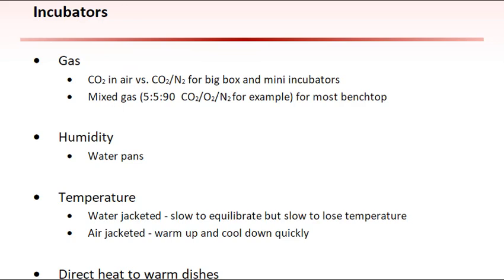Most incubator manufacturers produce incubators that can mix CO2 with room air at a designated concentration of CO2, or incubators that can mix CO2 and nitrogen, often captured from large liquid nitrogen tanks or a nitrogen generator, to create an internal environment acceptable for embryo culture. The purpose of pumping nitrogen into the incubator from an external source is to displace the oxygen within the incubator, resulting in an environment that has a lower oxygen concentration than the laboratory environment.